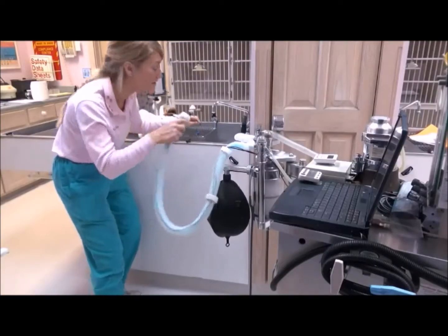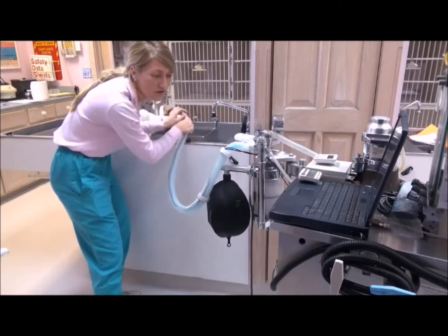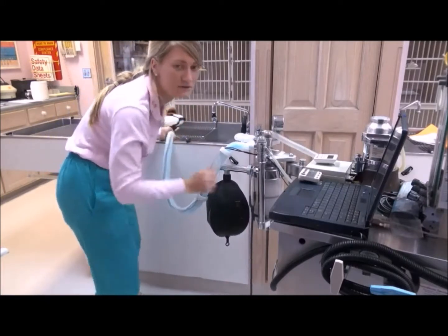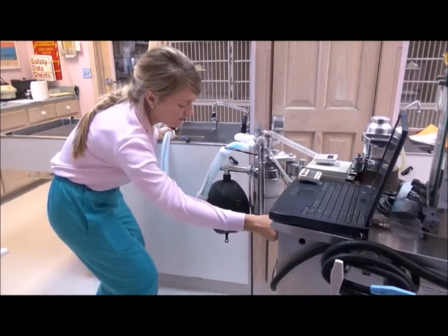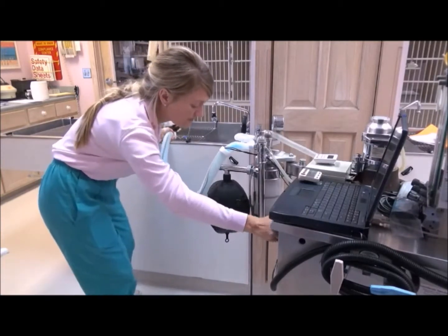Once this rebreathing hose would be connected to that endotracheal tube, that second person here would use the oxygen flush button or trigger, and they would fill up that rebreathing bag, or reservoir bag, excuse me.